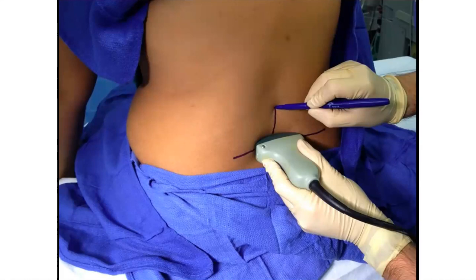Remembering that we are describing an ultrasound-assisted technique. So this means that the ultrasound is done prior to the procedure. Then once you've identified these landmarks sonographically, one then proceeds to perform the actual spinal anesthesia.